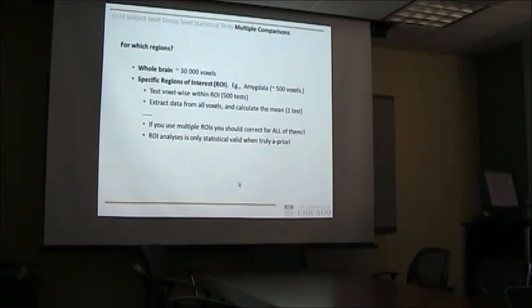If you then focus within these regions on whether there's a difference between your patient group and a control group, that would be fine. That test of differences between group A and group B would be, as they call it, orthogonal to the test that you did to determine which regions are significant across the whole group.